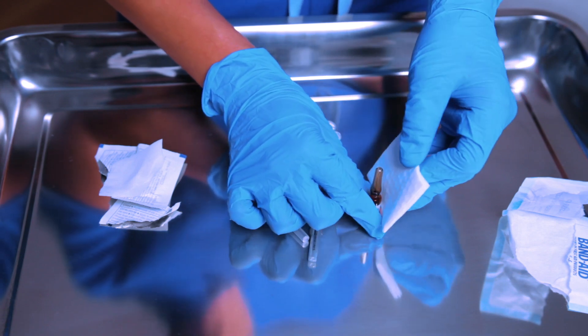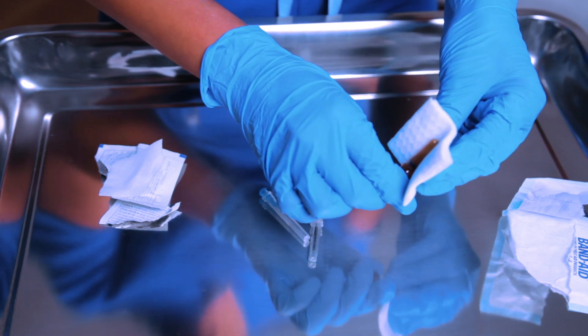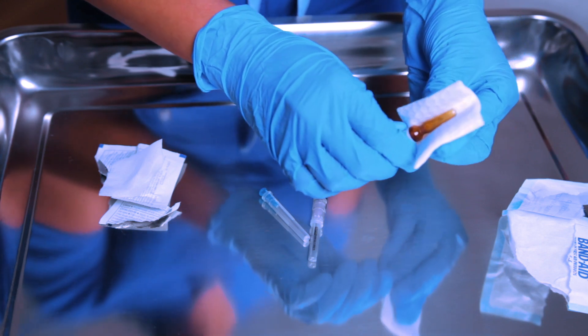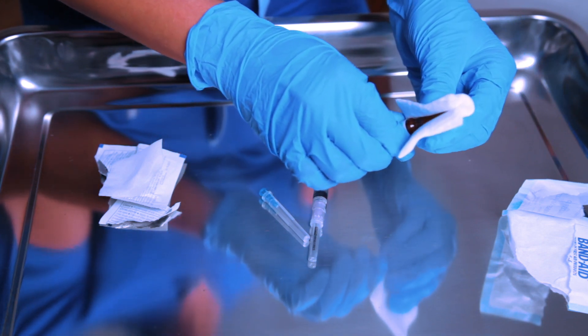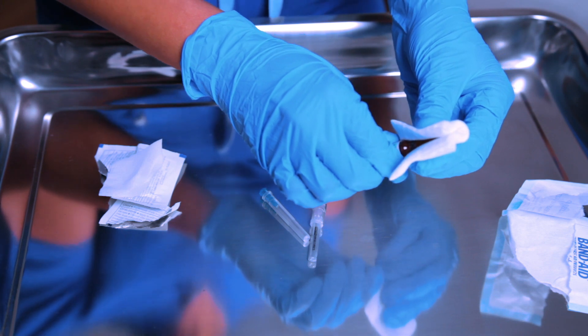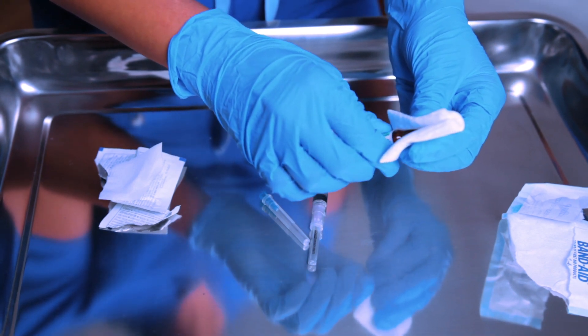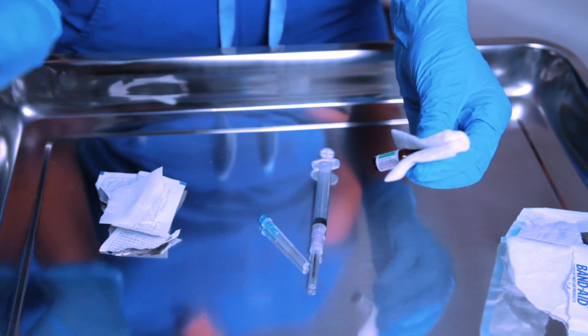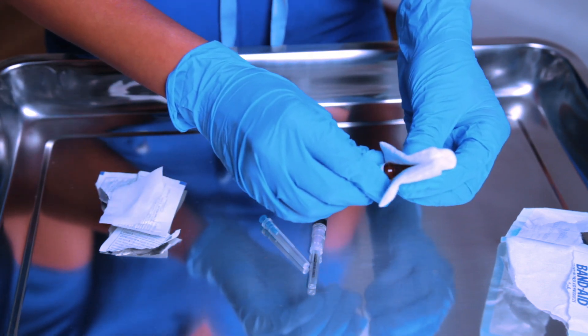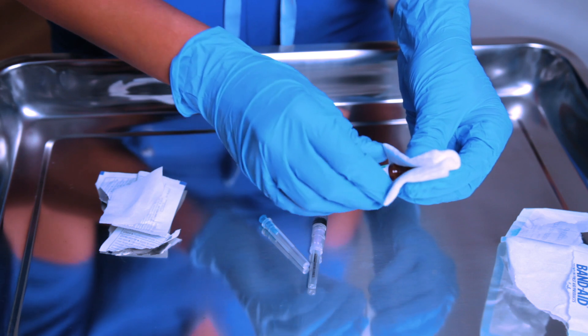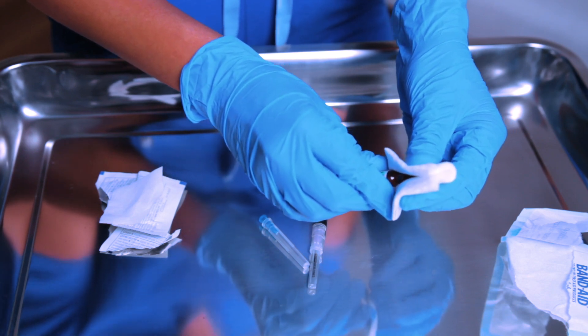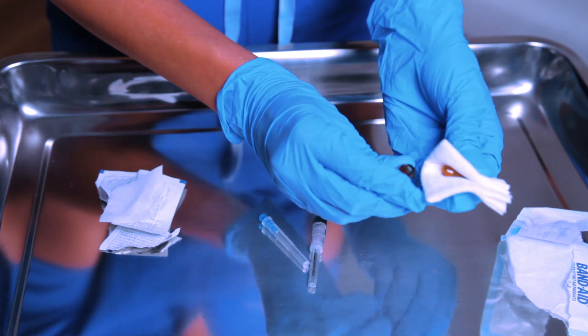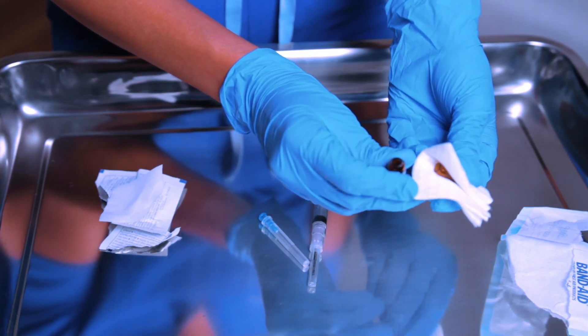I am going to put pressure around the neck and the body of the ampule. And I'm going to point it away from me because glass particles can spray out. So you don't want any of that to kind of contaminate your surface. So you want to point it away from you. And then you're going to gently crack it and you heard that and then it opens.